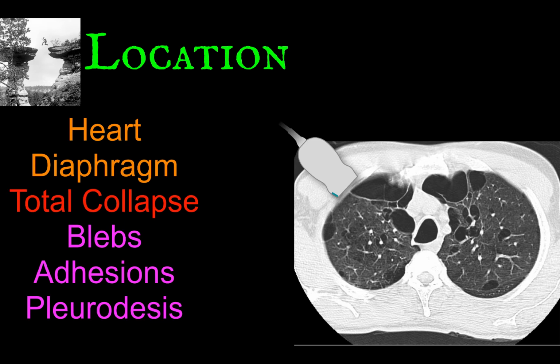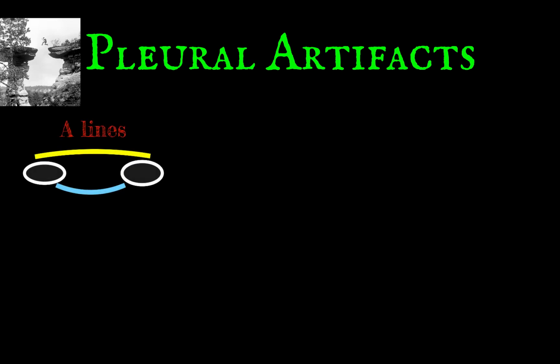However, there are also some lung artifacts that you need to know about, which can also tell you if the pleura are touching, and more importantly, can tell you if the lung parenchyma is too dense with fluid and inflammation, which suggests that you can harm your patient by giving too much fluid too fast. The first artifact you'll often see produces horizontal lines called A-lines. This is essentially a reverberation artifact.